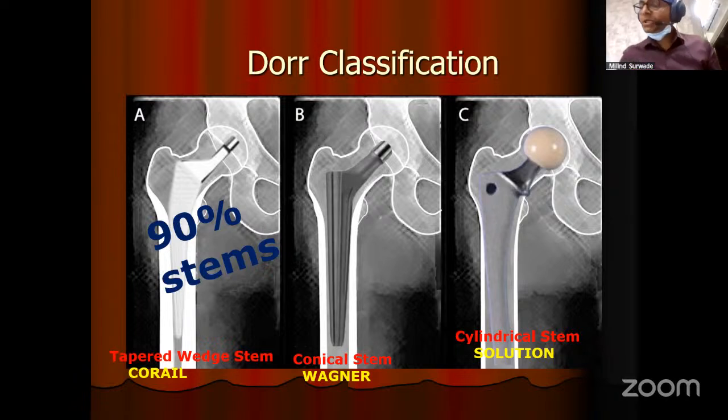Thank you very much. May I ask one more question? Whether Exeter design cemented stem versus a Mueller design. Nowadays they have Mueller design also in cemented. So which one is your preference? Like the C stem is kind of an Exeter type of stem, the straight collarless polished stem. I prefer the Exeter stem, frankly.